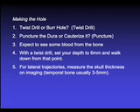Sometimes you will see blood. Most of this comes from the bone. And with a twist drill, it's important to not simply go 1 centimeter through the bone, believing that the average diameter of a person's skull is a centimeter. In fact, I found that the average depth is approximately 6.5 millimeters. I set my depth to 6 millimeters, and I walk down from that point until I eventually just break through the inner table of the skull. Of course, for lateral trajectories of the temporal bone, the bone may be very thin.